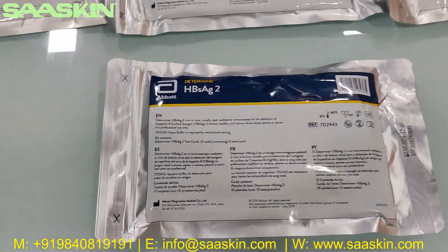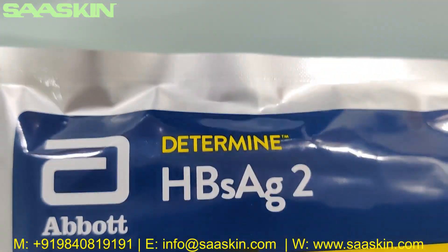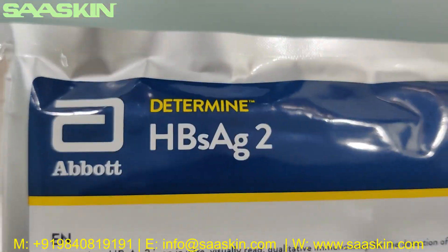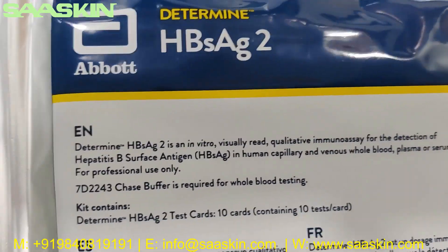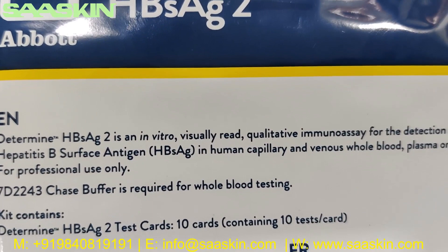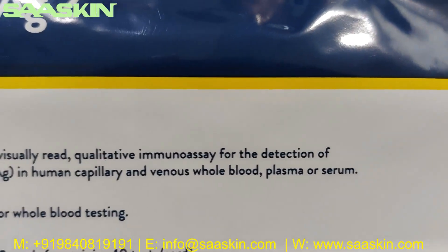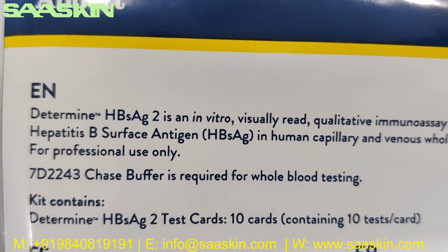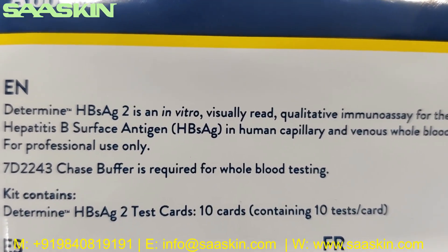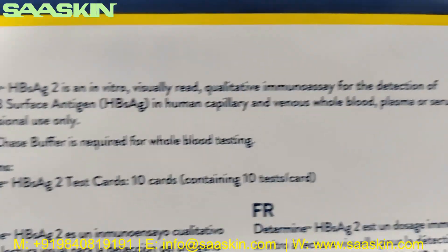Hello everybody. Today we are going to see the packing and introduction of the product Abbott Determine HBsAg2. This is from Abbott. Basically, the Determine HBsAg2 is an in vitro visually read qualitative immunoassay for the detection of hepatitis B surface antigen (HBsAg) in human capillary and venous whole blood, plasma, or serum.